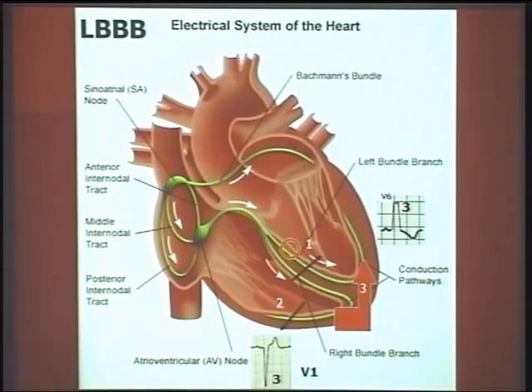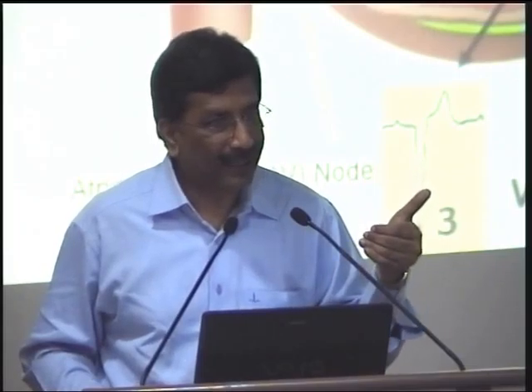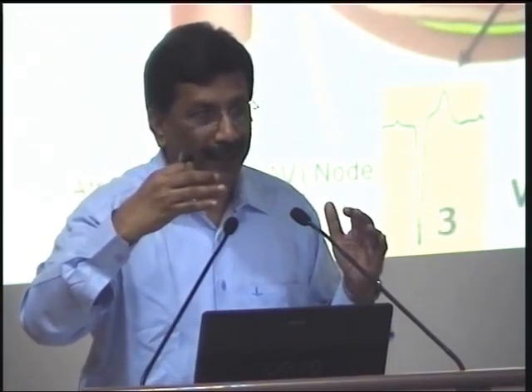So, that is what I told you. The concept to understand in a bundle branch block is that whichever ventricle's bundle is blocked is going to be activated last. For that, the impulse has to come through the muscle, a non-specialized conduction system traveling at the speed of 400 millimeters per second rather than 4000 millimeters per second. So naturally, this last vector is going to be delayed and slurred because it is coming very slowly. The ventricle whose bundle is blocked is activated last, in a delayed manner, which results in a terminal, delayed, slurred deflection. All three words are important: terminal, delayed, slurred.